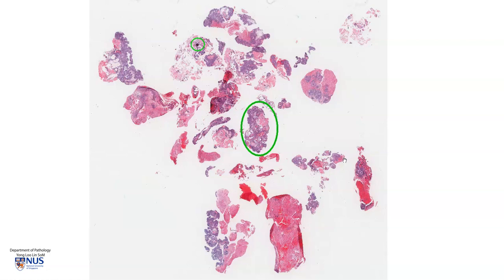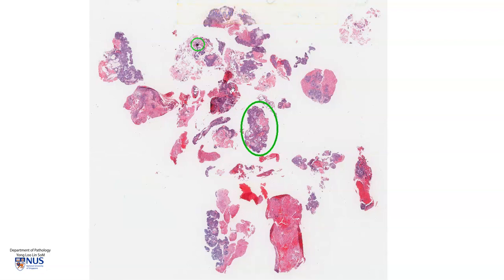Hello, this is a virtual microscopy slide showing an example of a craniopharyngioma, adamantinomatous type. On low magnification, we can see that this is very fragmented, and of course this is because of the result of surgery in such tumors.